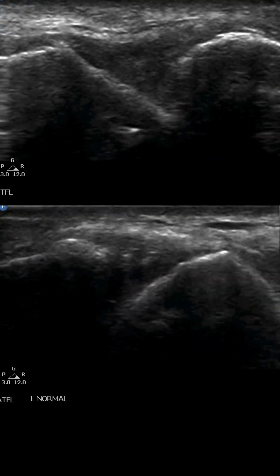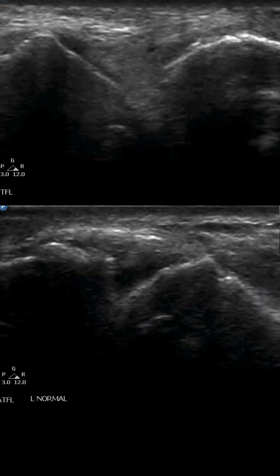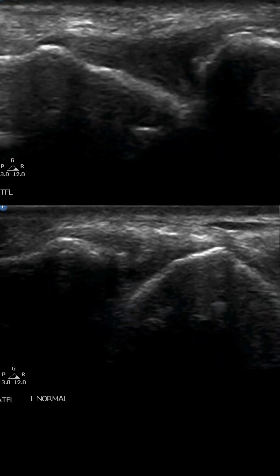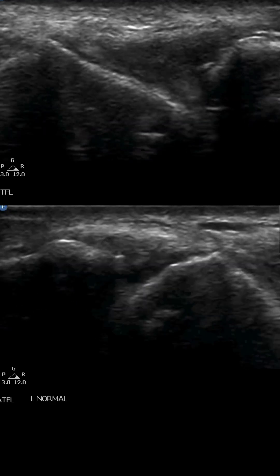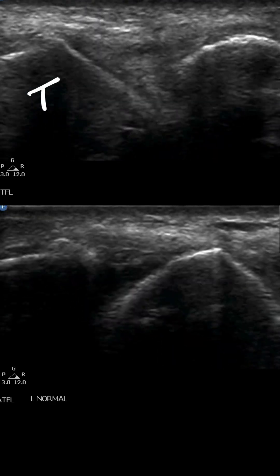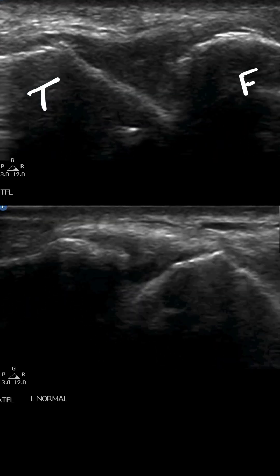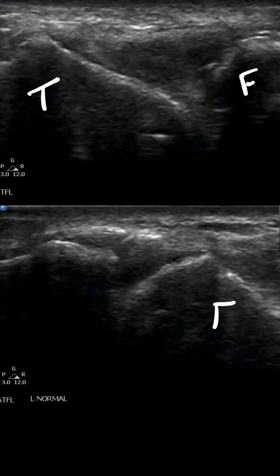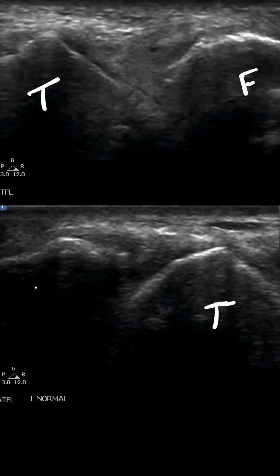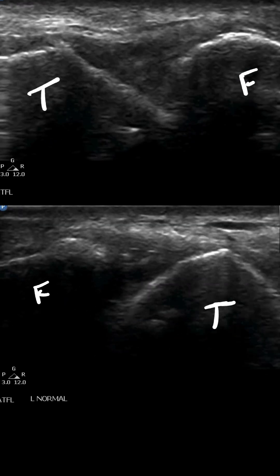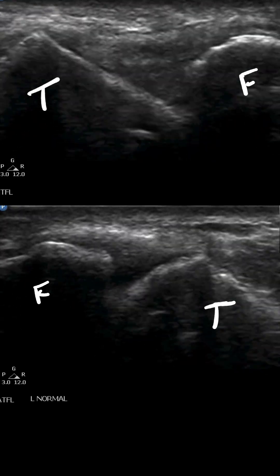What we're looking at is the ATFL location on both the right side — upper image — and the left side — the lower image. For context, the bone on the left is the talus, the bone on the right is the fibula. In the lower image it's inverted, so the talus is on the right and the fibula is on the left. The space in between is the location of the anterior talofibular ligament.